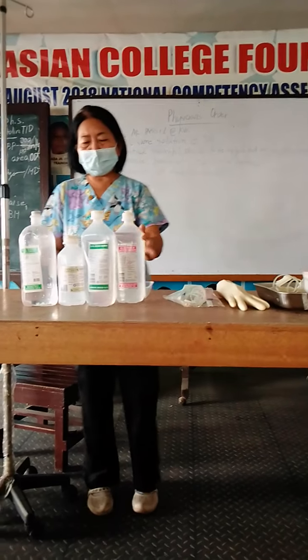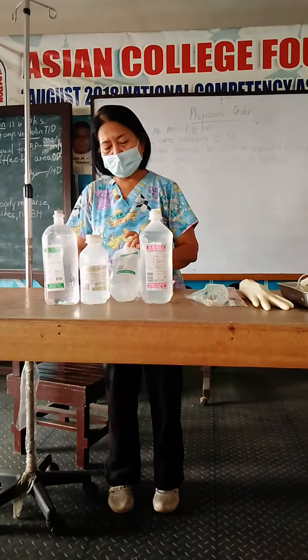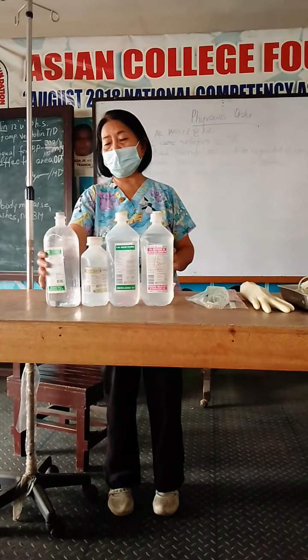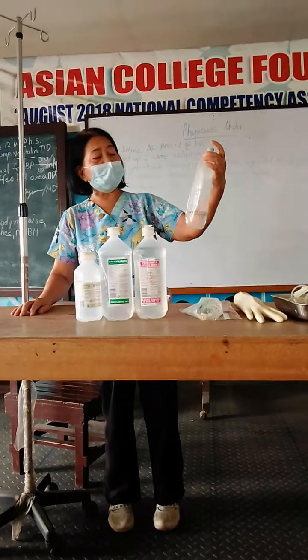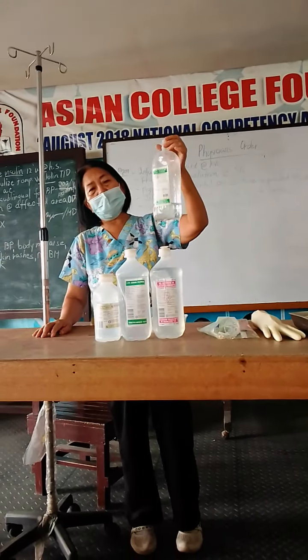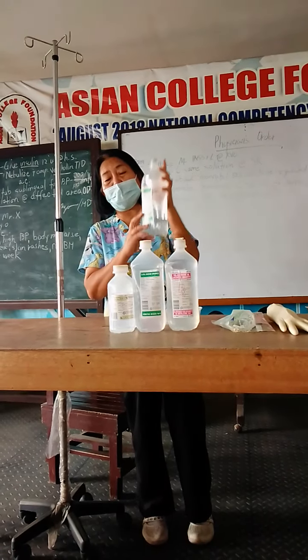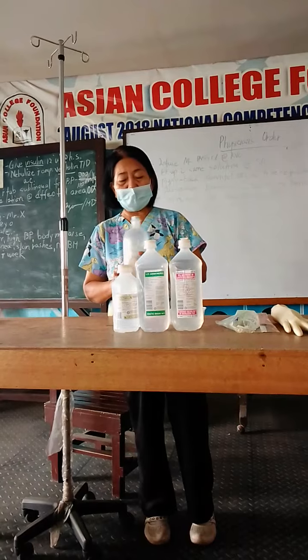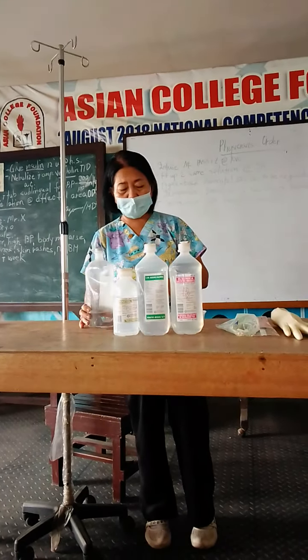I've read it to you already. The doctor's order is to insert PNSS 1 liter, which is 0.9 sodium chloride, 1 liter. It comes in 1 liter. There is also a preparation that is only 500 cc, compared to 1000 cc. So I've read the doctor's order, and it is the 0.9 sodium chloride.